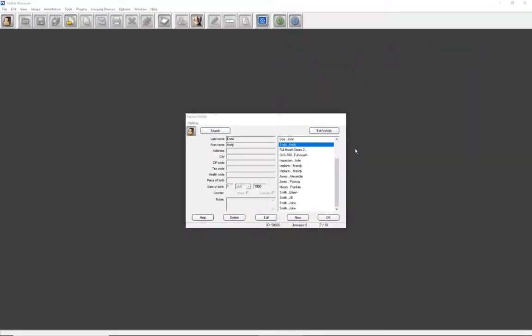Welcome to a GINDEX video training series that demonstrates the functionality of VIXWIN Platinum 3.5 imaging software. This tutorial will show you how to capture digital images in the Windows layout view. Radiographic 2D images taken by phosphorus plate scanners, panoramic and cephalometric units, and intraoral cameras and sensors may be automatically acquired into VIXWIN and then selected for treatment, analysis, and saving.